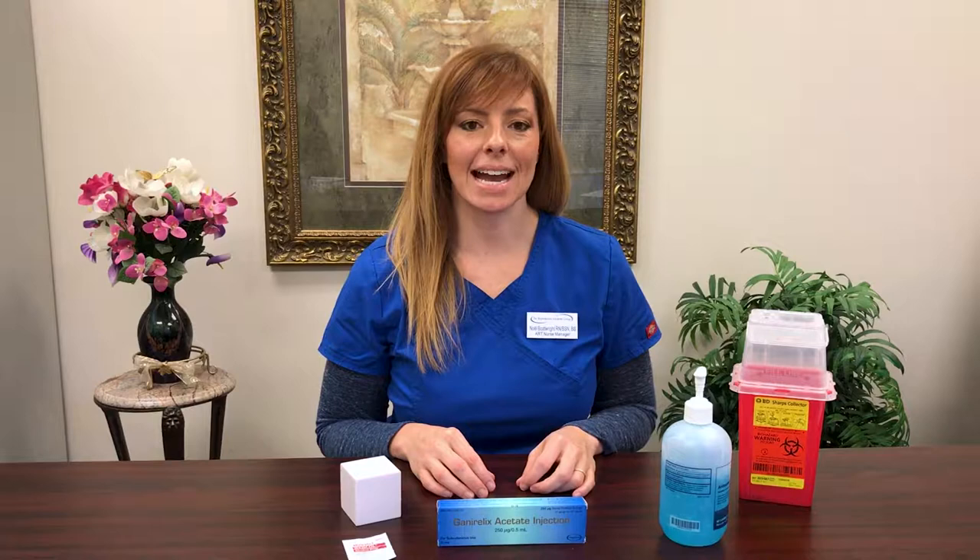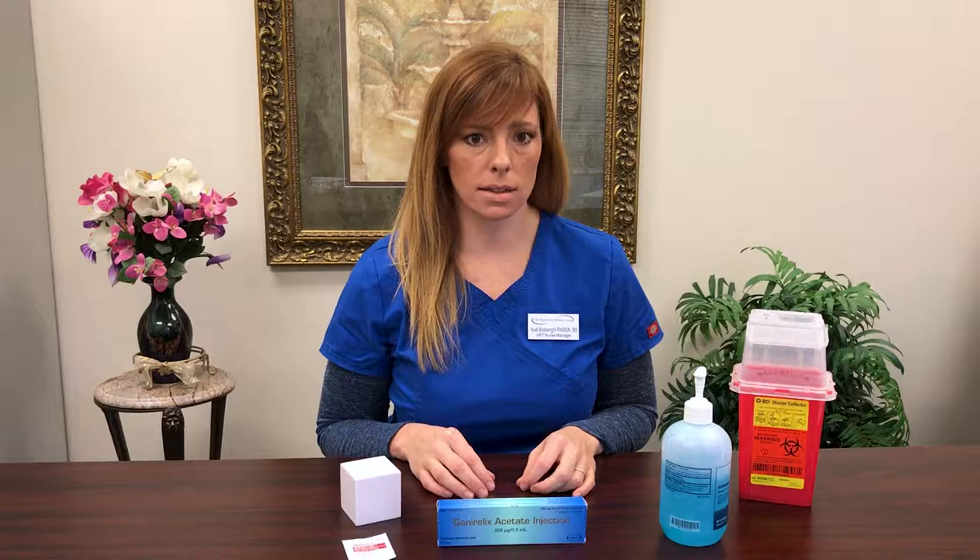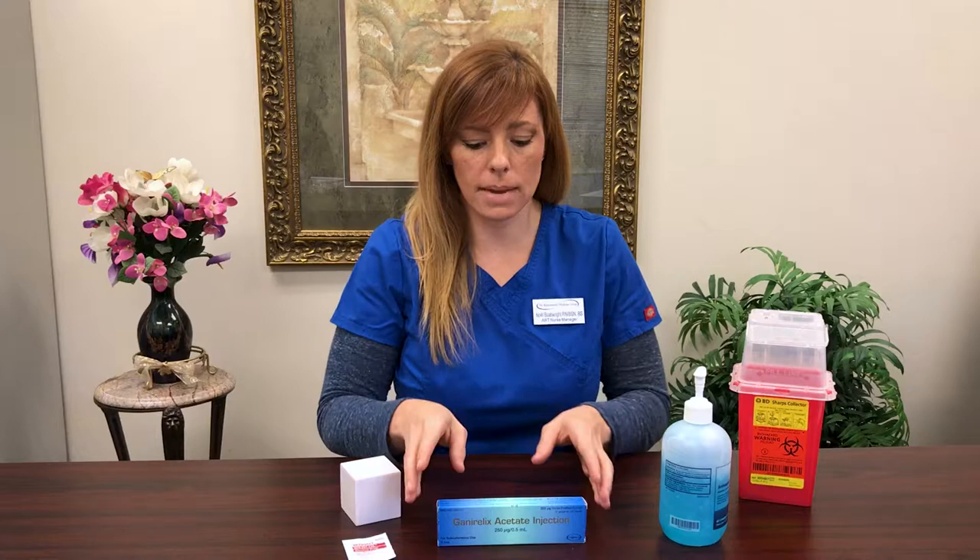Hi there! It's time to learn how to do your injection for Ganorelix. This is a brand specific drug — there is no substitute. So when you see that Ganorelix has been ordered for you, I want to make sure that you have a box from your pharmacy that looks exactly like this. It's a blue box.